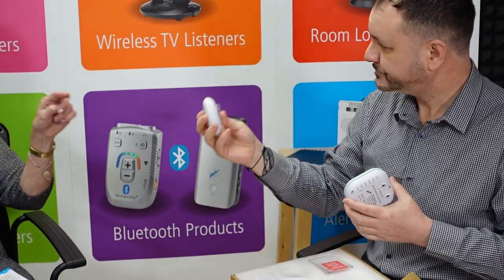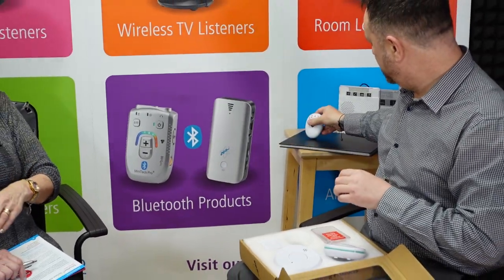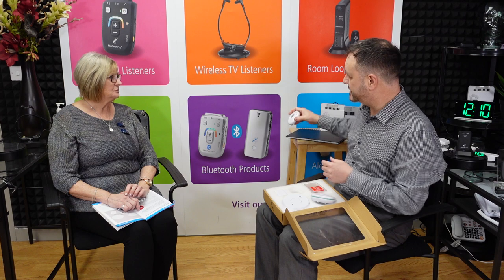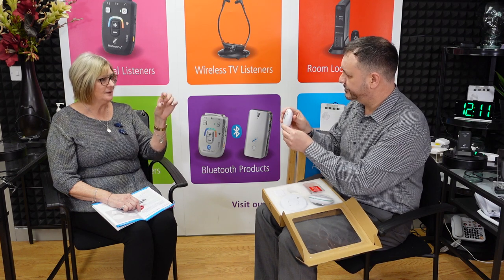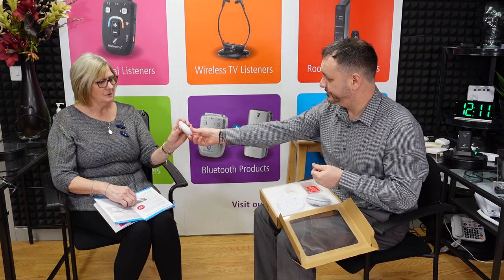That's the pager unit that comes with the system. Do we have to hold it physically or can we put it on a desktop or on top of the TV? Yes, it can be sat on the side. It will alert you to which device has been triggered, and it can be attached to your belt — it's got a belt clip on the back. It has a two-year battery life, so it's not something you constantly need to deal with. It uses two double-A batteries in the rear.